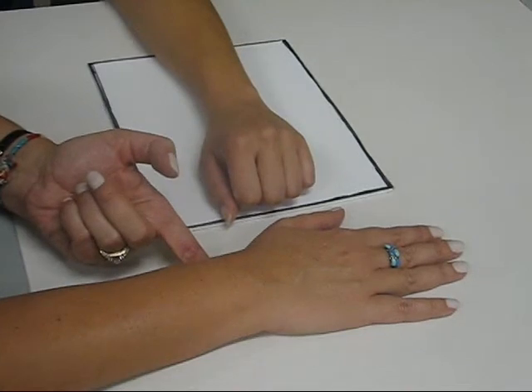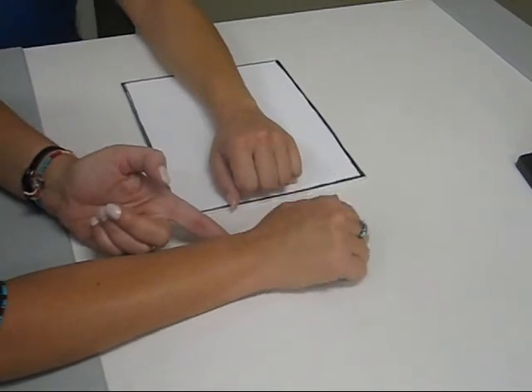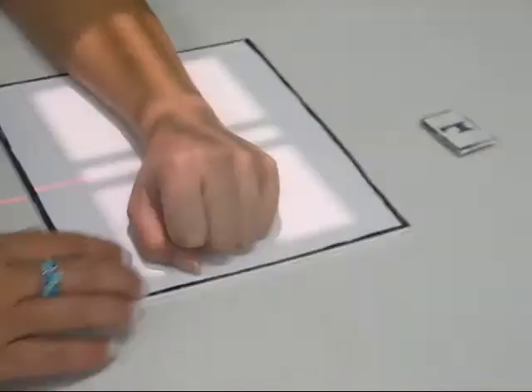So there may be a little bit of magnification due to that. However, if you make a fist, your wrist will immediately go down, and there's no way you can put anything under there. So that's the position of the wrist for the hand.